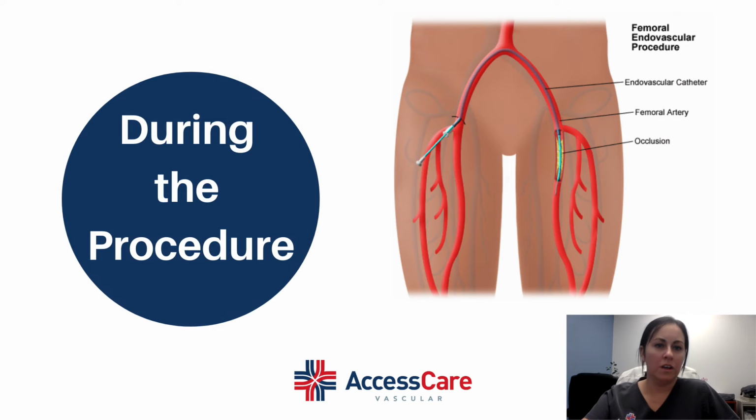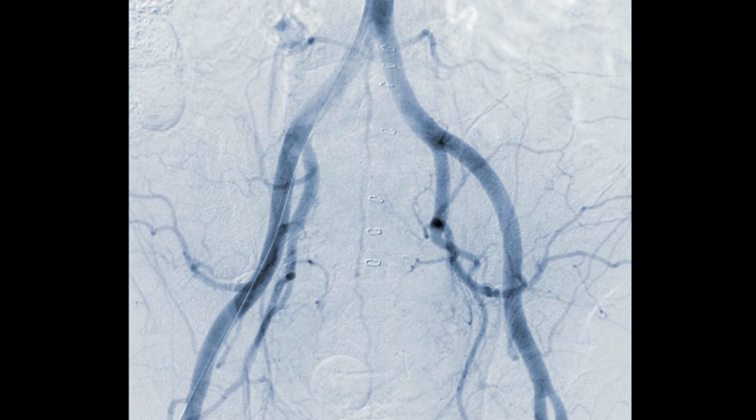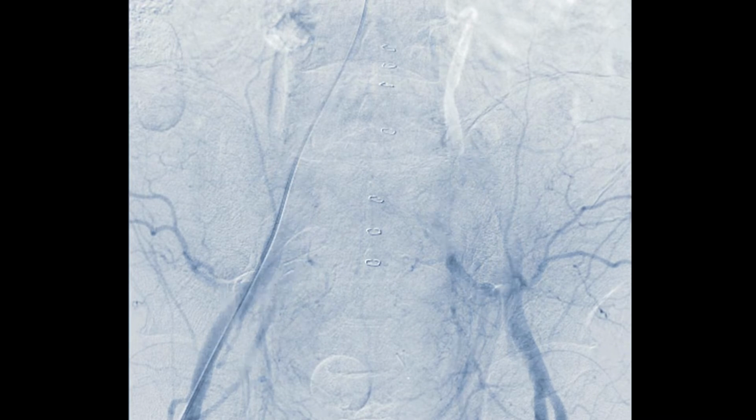After the puncture, when access is gained to the artery, they will guide wires and long thin tubes called catheters in your arteries and over to the leg with the plaque. This technique allows the surgeon to be able to access and visualize all of the major arteries in your affected leg. Next, the surgeon will inject contrast dye in the vessel and will use X-ray technology to visualize the blood flow in your leg arteries.